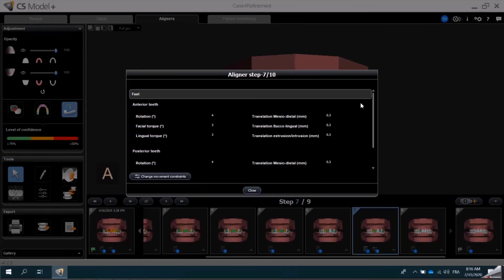This concludes the demonstration of how to generate the Aligner Steps in CS Model Plus Version 5.